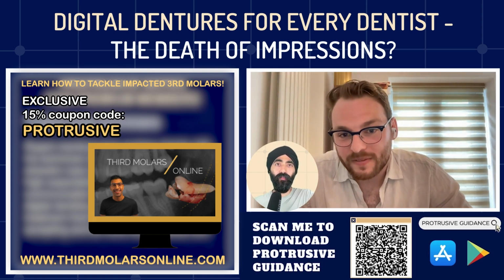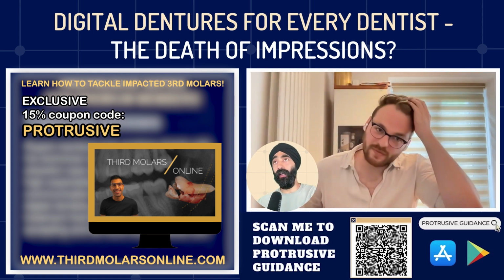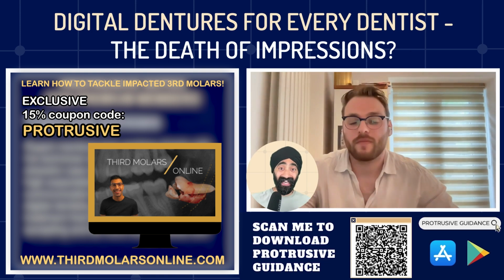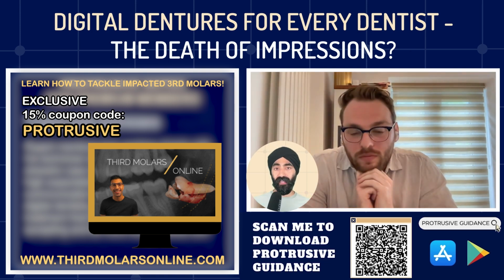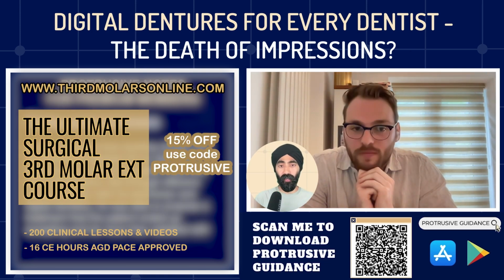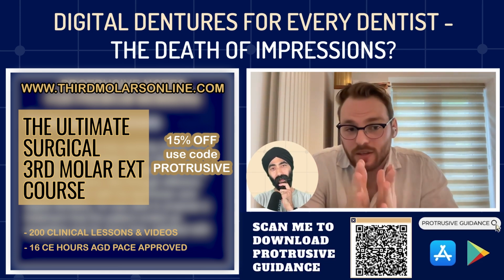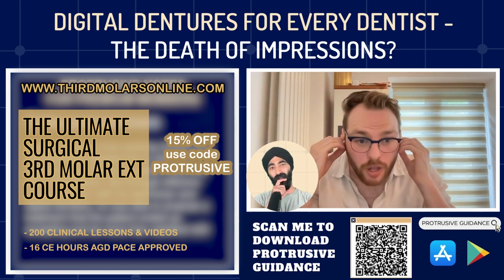This is like the equivalent of doing really good temporary veneers. It gives the patient a clear idea of what they're expecting, and they come back and say, yes, this is what I want. There's no confusion about shade in the future. There's no friction and communication errors. That is really nifty.